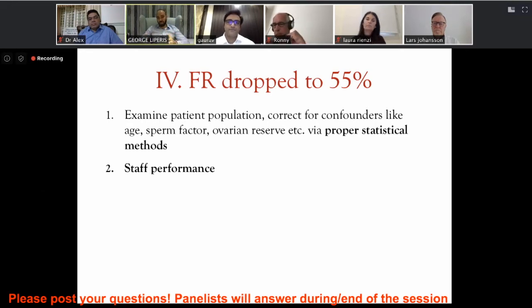But for example, following the protocols, let's say I noticed once one embryologist loading more than the insemination volume, and when I asked why are you doing that, the preparation form says that is different, and the answer was just to make sure. So you understand that staff performance is required not only for the ICSI process, it's also for the IVF. Of course, for ICSI, you can compare the fertilization rate and see whether those differ between different operators and whether there is a problem in training or a need for retraining for a specific member of staff, but that also needs to be looked after.